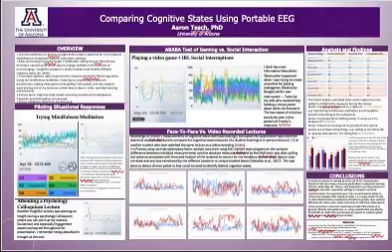So the second factor seemed to correspond to periods where engagement, stress, relaxation, and focus were changing together, but not necessarily in the same direction. So I termed the second factor transition, because it corresponds to periods of time where there was change happening in these factors.